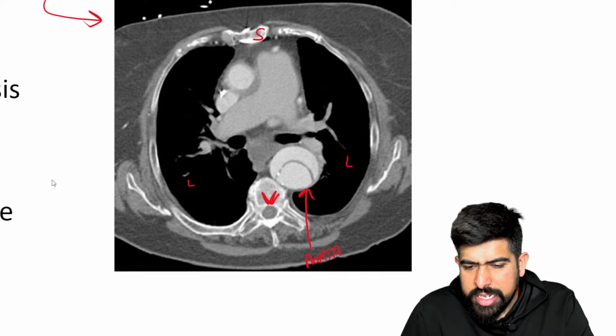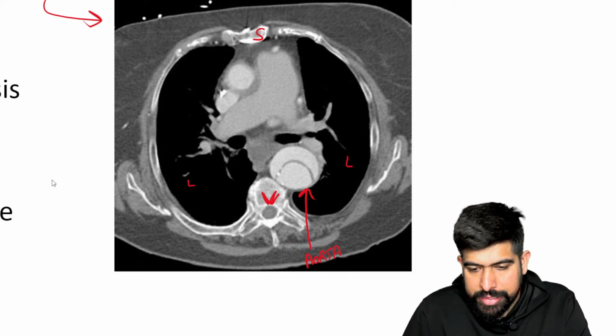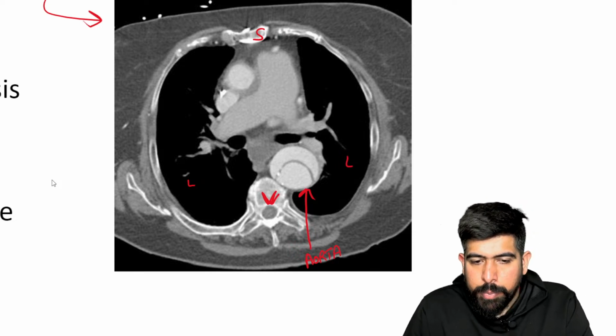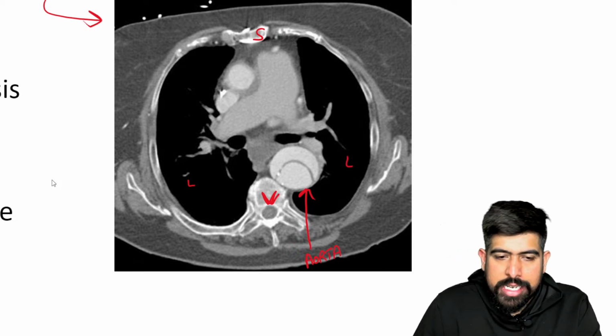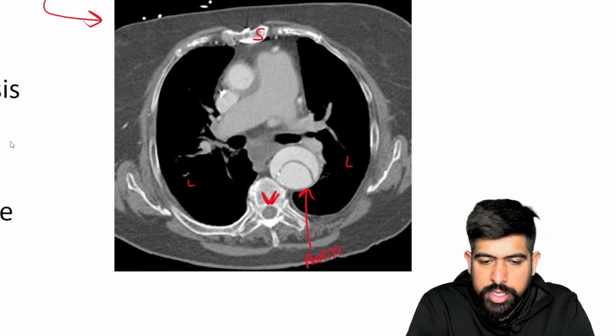Tennis ball is not the clear sign. This is known as the crescent sign. You can say tennis ball also, it seems similar, but tennis ball is seen in a different condition. Tennis ball is just totally different. I think it's clearly seen to you now. The option is clear to you, and you made the diagnosis. Okay.